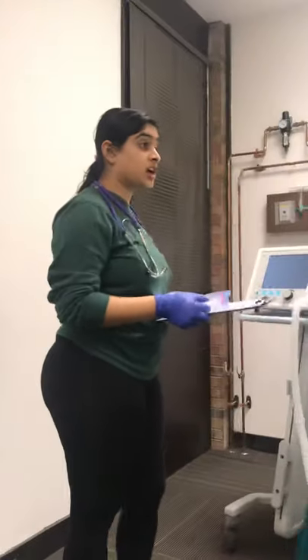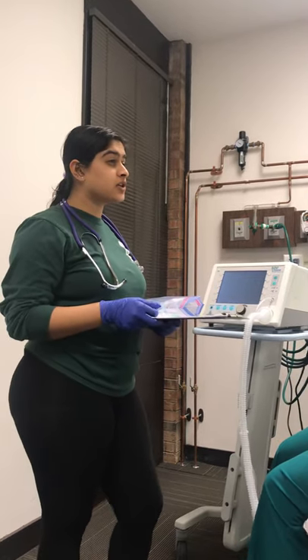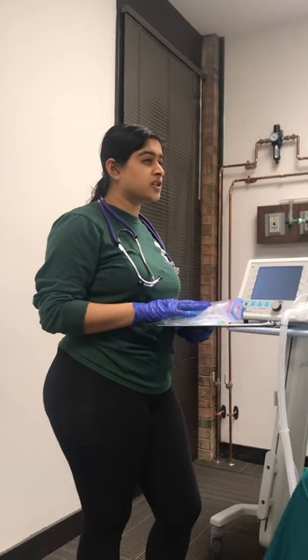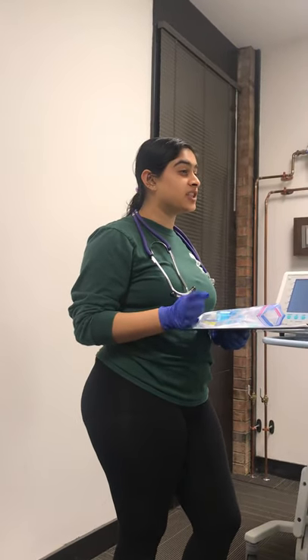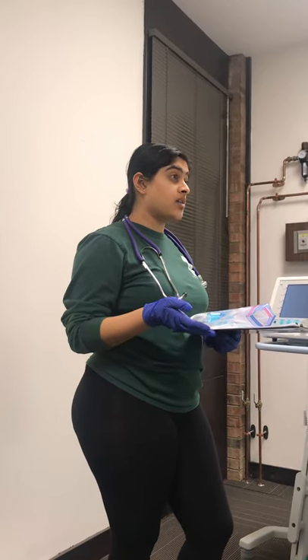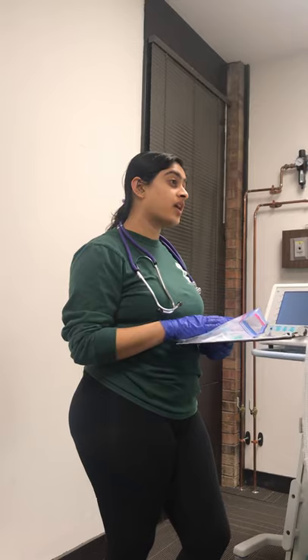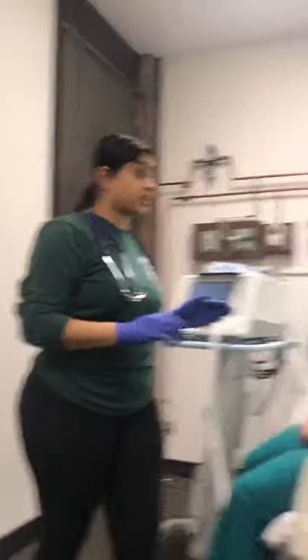Hi, my name is Maytree, I'm your respiratory therapy student for today. We've received your second ABG — the blood draw we did on your wrist — and it looks like your CO2 has gone up, so it looks like you feel a little sleepy right now. We're going to switch you to a new mode called ST mode. Basically you're going to feel pressure from breathing in and breathing out, and that's going to help bring down the CO2 so you don't feel sleepy anymore. I also have an albuterol treatment for you every four hours. So I'm going to take off your mask.